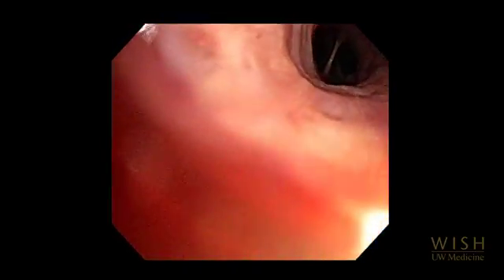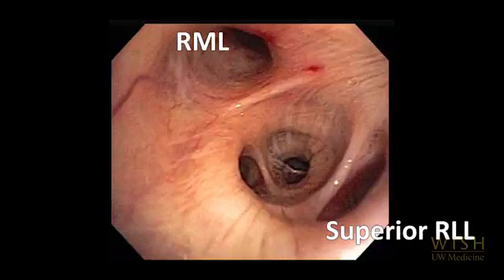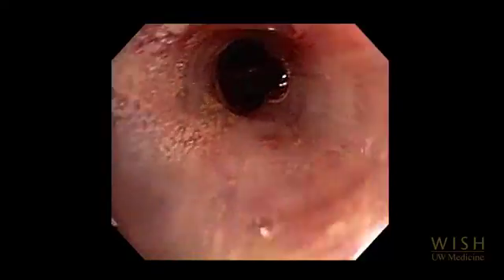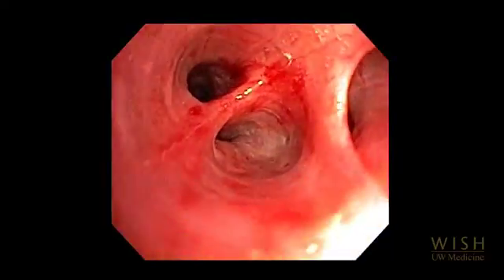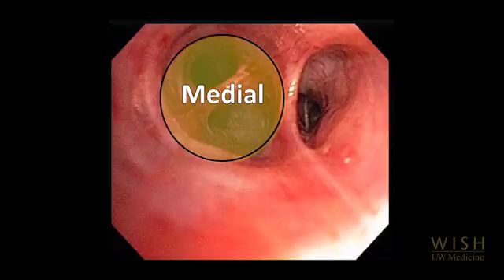The bronchoscope returns to the right main stem and then continues into the bronchus intermedius, which runs from right upper lobe takeoff to right middle lobe takeoff. The right middle lobe takes off anteromedially. The superior segment of the right lower lobe takes off posteriorly at the level of the right middle lobe bronchus. The medial basal segment takes off medially, and the right lower lobe bronchus continues distally.